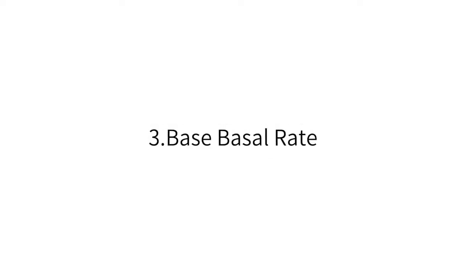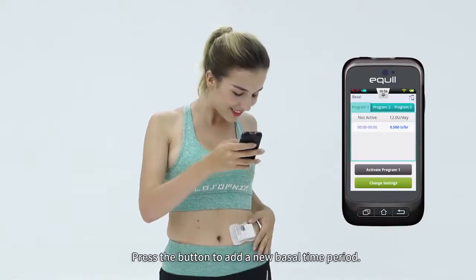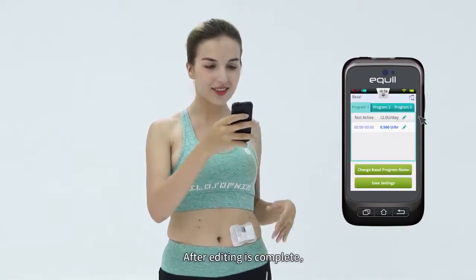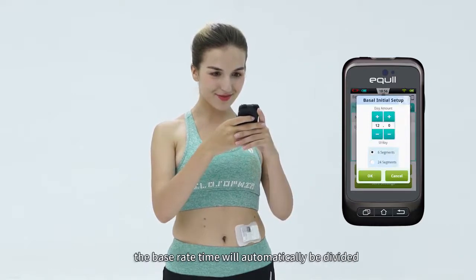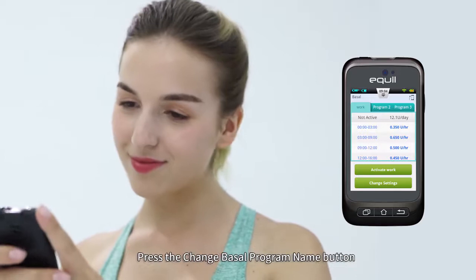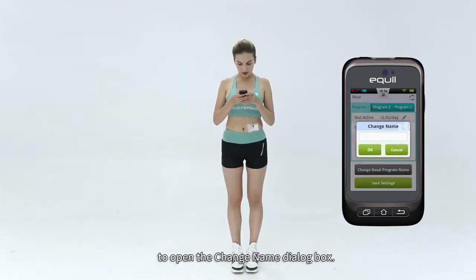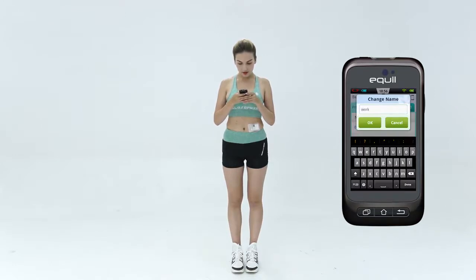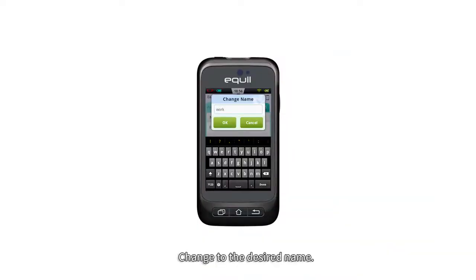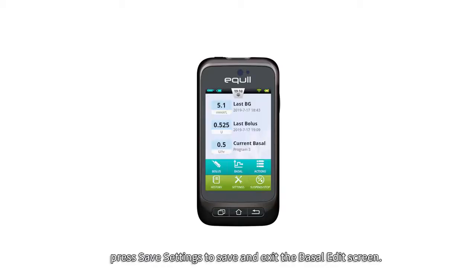3. Base basal rate. Press the button to add a new basal time period. After editing is complete, the base rate time will automatically be divided into multiple time periods. Press the Change Basal Program Name button to open the Change Name dialog box. Change to the desired name. After you have completed editing the basal program, press Save Settings to save and exit the basal edit screen.